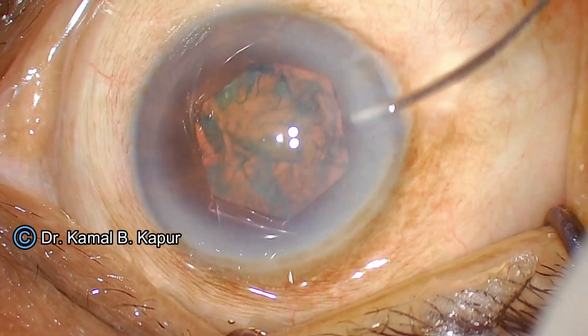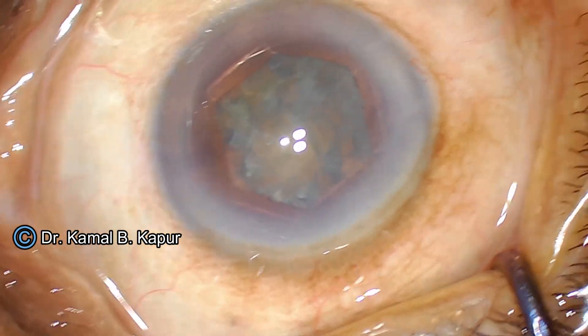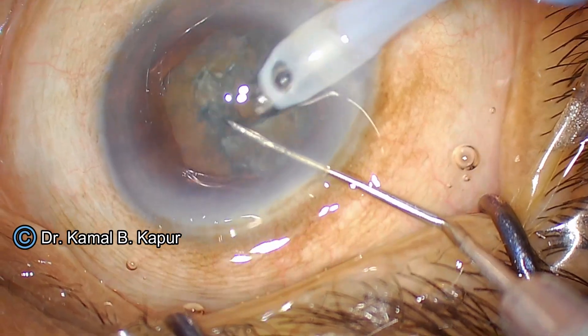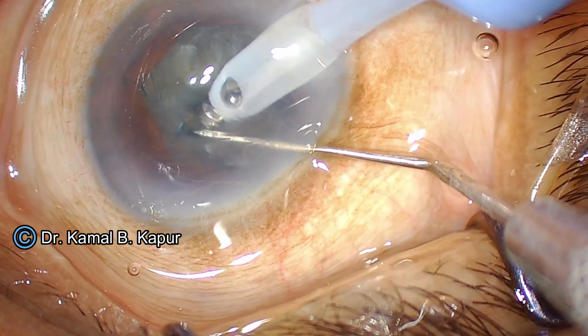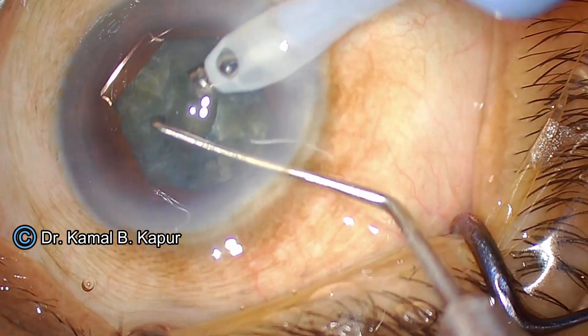I ensure a good amount of hydrodissection and rotate the cataract numerous times, which will help in irrigation aspiration of the cortex. Since this is a very soft cataract, I will carefully try and chop it. I have to keep in mind that I have a small rhexis and must avoid the edges of the capsulorhexis, and even my phaco tip has to remain away from the capsulorhexis.